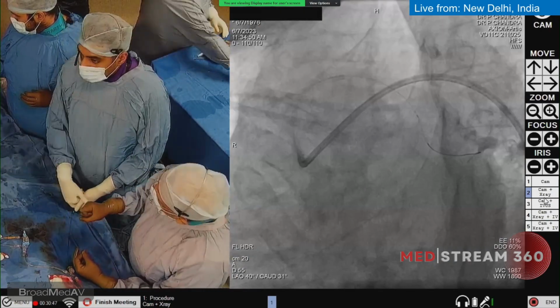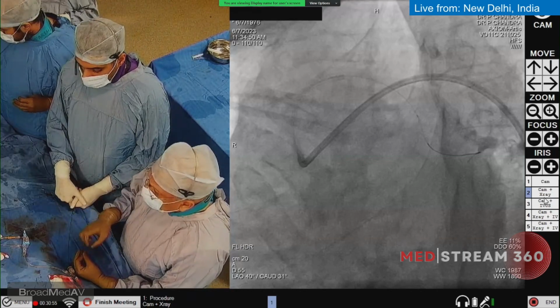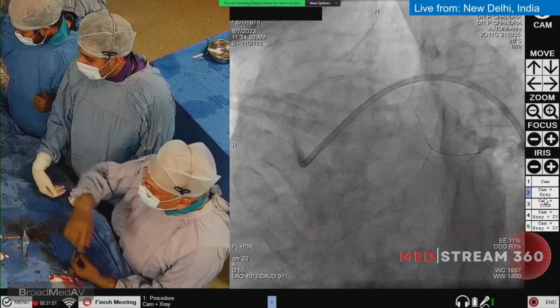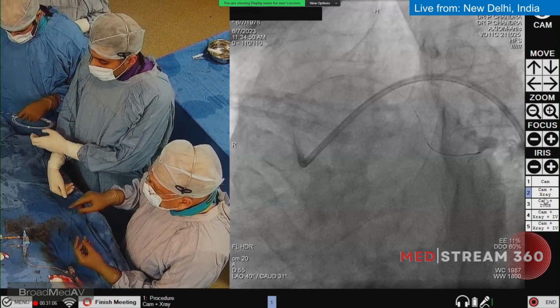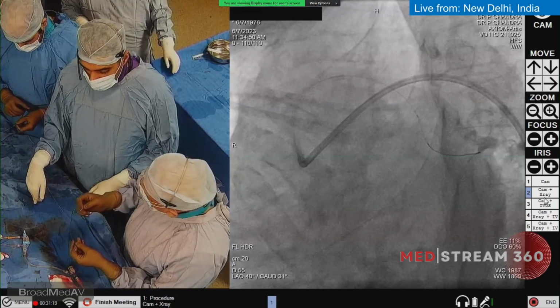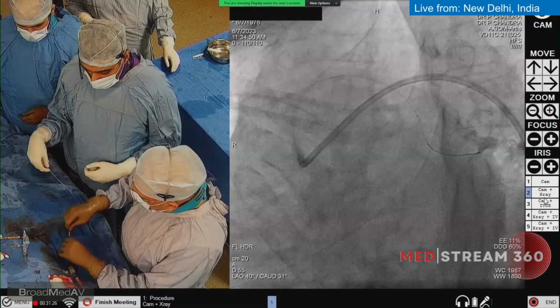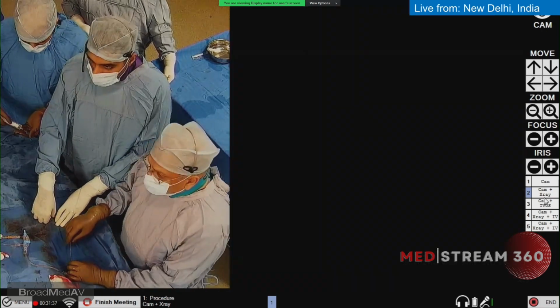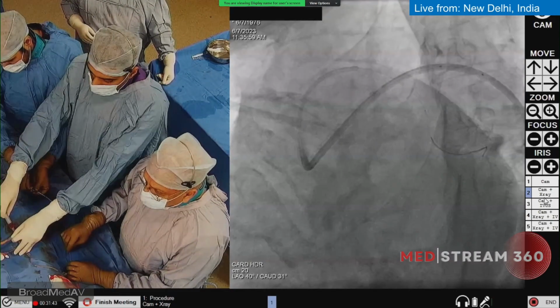So the plan is to take a drug-eluting balloon because, as I already said, if we put a stent, there is a very high chance that the flow in the OM will completely stop, and also there will be an issue for the LAD, which is arising from that bifurcation, just near this lesion in the circumflex. This is a 2.75 into 15, and this is a sirolimus-eluting balloon from Meril. The coating of the balloon is such that the drug stays inside because it has microspheres, and the drug will stay inside the tissue for up to 90 days. In the studies, it has been shown.